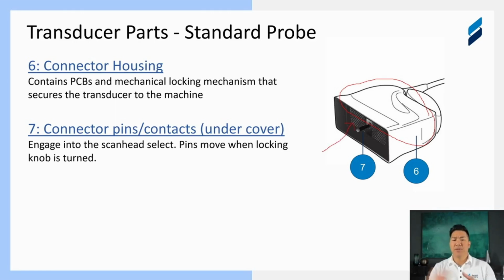And so now, moving on to the connectors and pins, they're in here, and there's many different kinds of pins out there for different kinds of transducers, a variety of interconnects, but it's really important that those connector pins are securely locked to the ultrasound system. If not, that can cause some noise, because you move it around a little bit and it opens, where it should be a closed circuit, and then it kind of comes back together, and you'll see some noise coming up on the image. So something to keep track of there.